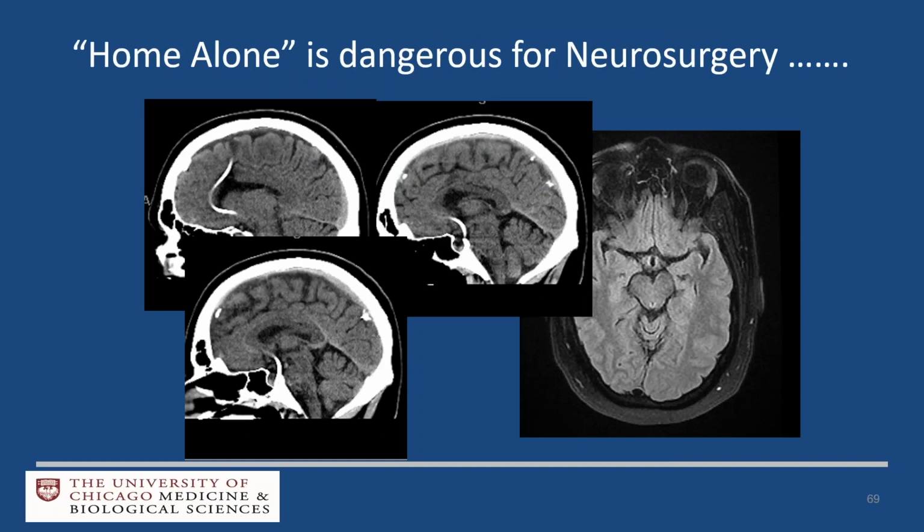And this is what you don't want to do. This is a patient that came from the outside, idiopathic intracranial hypertension. A shunt was placed. The shunt actually worked. As you can see, you can drain CSF also from the suprasellar cistern, but the patient had a classic postoperative bitemporal defect, and as you can see on the MRI scan on the right, the trajectory of the shunt, which is way too long, went straight through the chiasm. So if you use intraop CT, this should not happen.